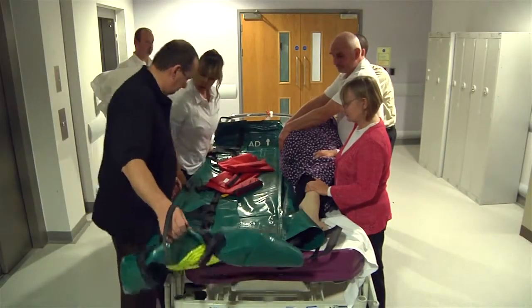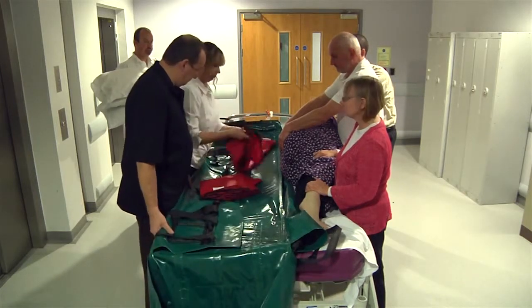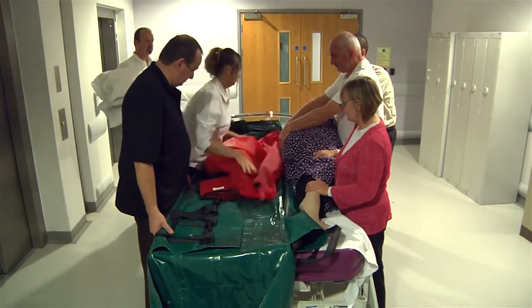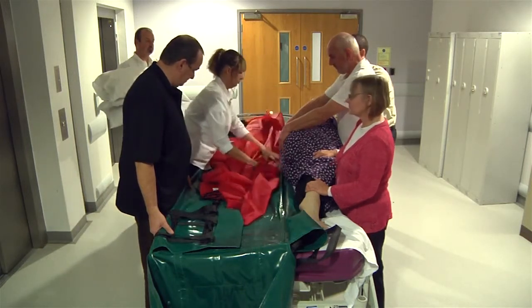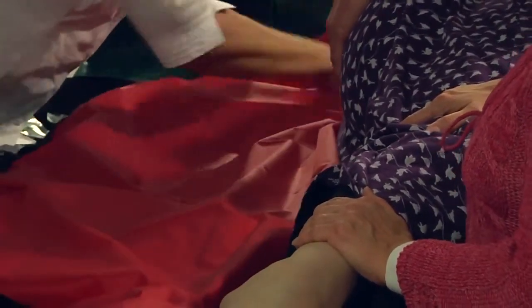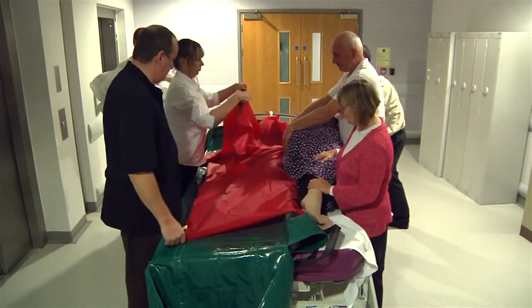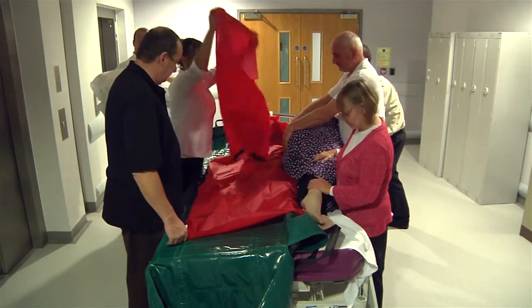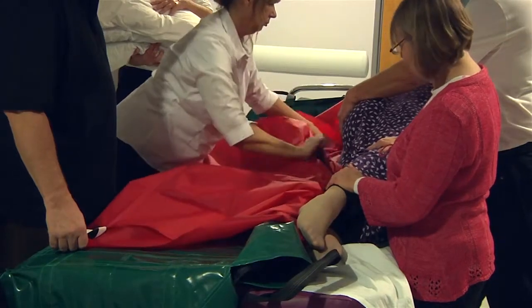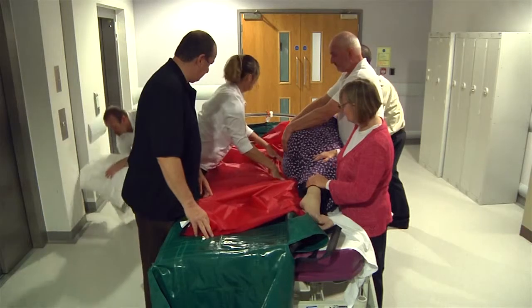The patient will then need to be transferred onto the evac mat, either on the bed or on the floor, by safe means using approved moving and handling techniques suggested by the qualified personnel who are available at the evacuation. Slide sheets can be used if available. It may be useful to have bariatric slide sheets stored with or close to the evac mat, then roll them back onto the evac mat.